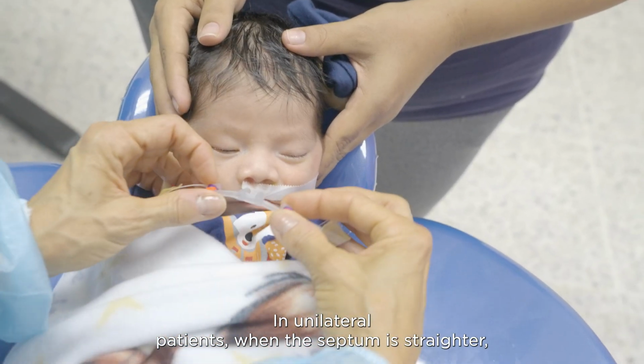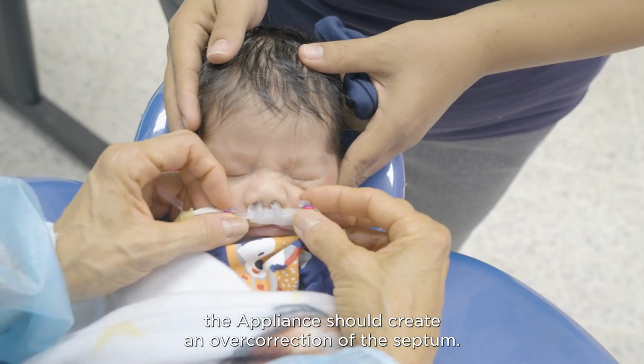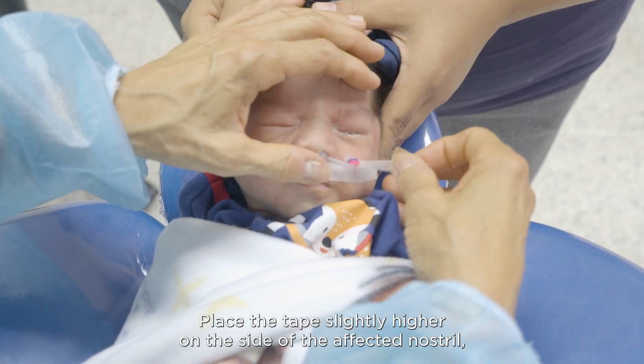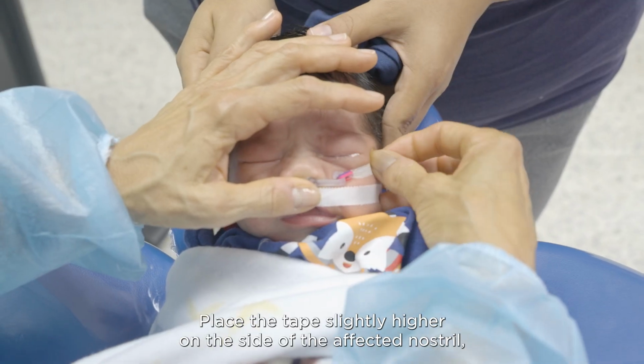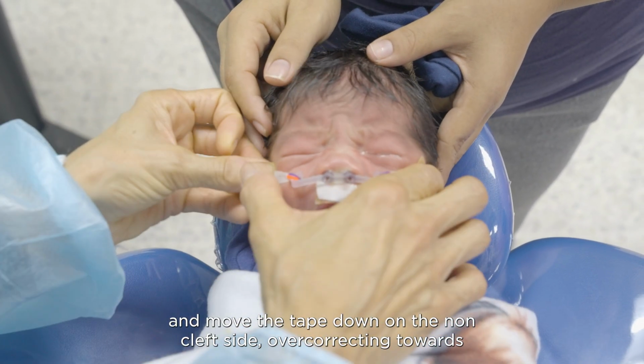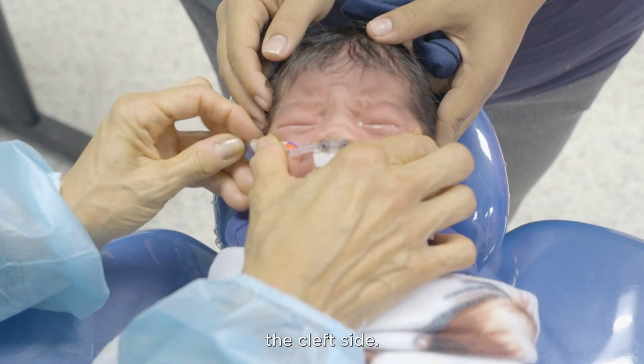In unilateral patients, when the septum is straighter, the appliance should create an overcorrection of the septum. Place the tape slightly higher on the side of the affected nostril and move the tape down on the non-cleft side, overcorrecting towards the cleft side.